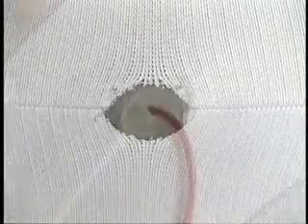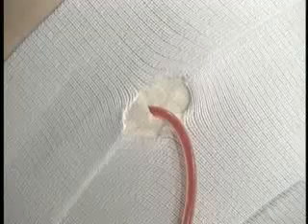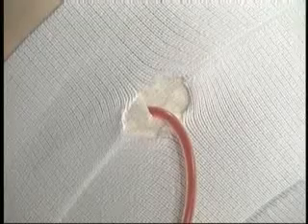Cut away any loose fibers from the fabric around the area of the hole. The binder will not unravel and will retain its properties for providing support and compression, even if the cut crosses the gap-free stitching that joins the panels.